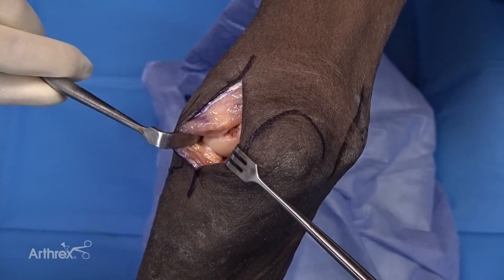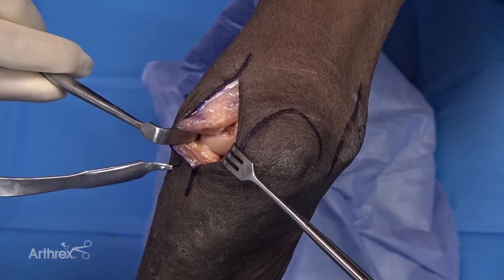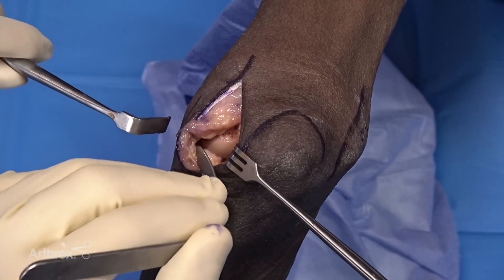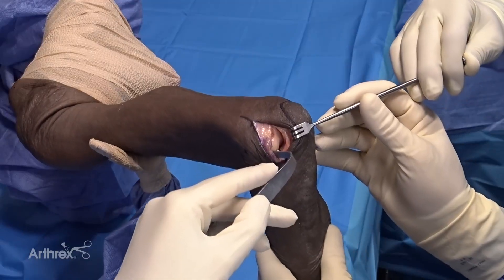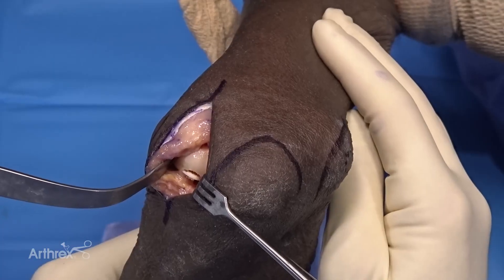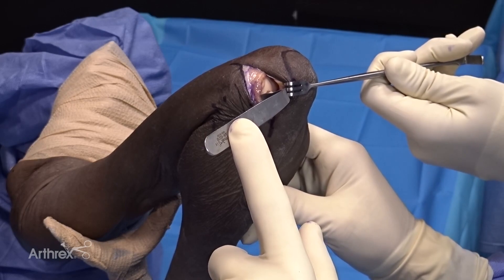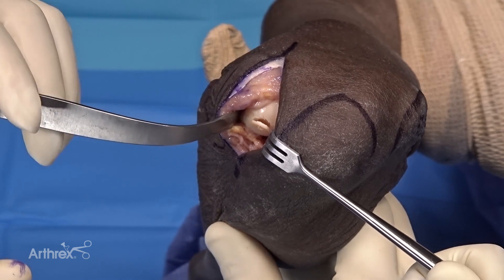Once the capsulotomy is complete we'll proceed with placing deep retractors so that we can flex the elbow to deliver the diseased portion of the capitellum into our operative field. A small Hohmann that is curved will be placed first laterally. As we flex we can begin to visualize the OCD. With the elbow hyperflexed, the OCD is fully visualized as well as providing perpendicular access to the articular surface.